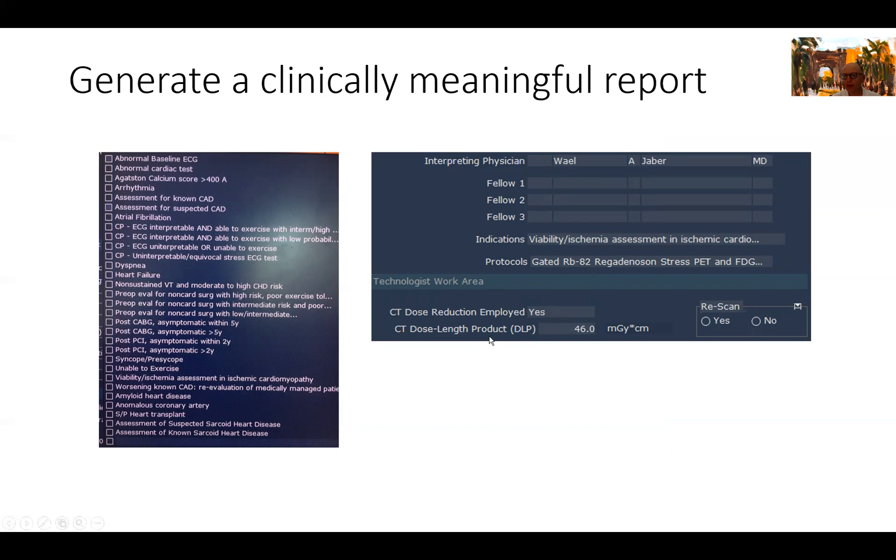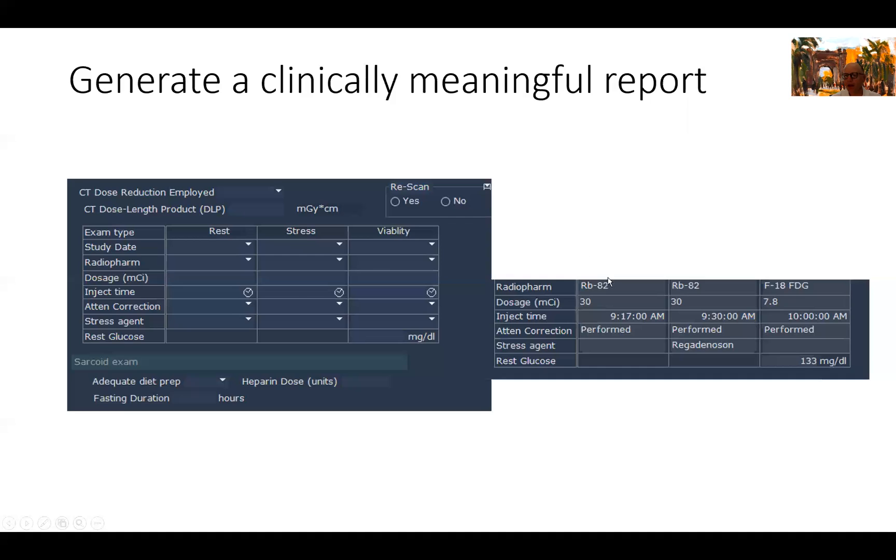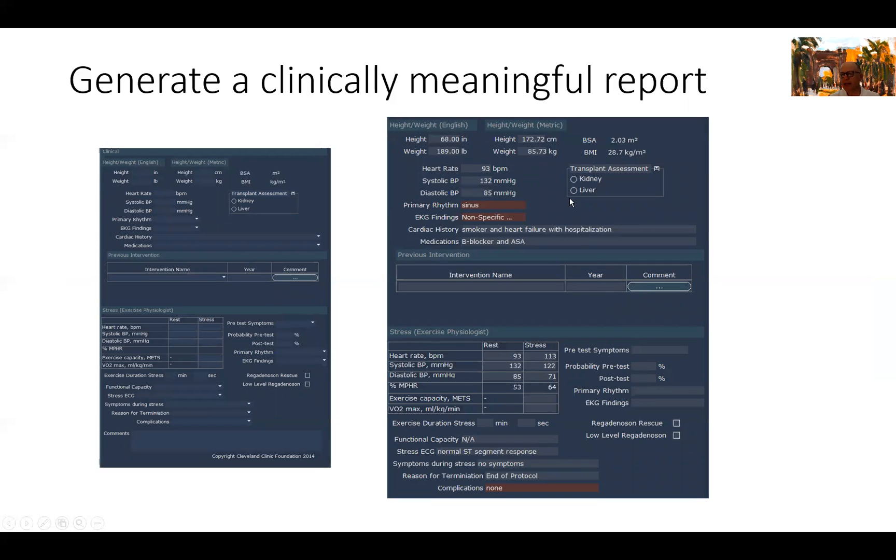Now we go to report the study. We have to report the indication for the study right here, as you can see. Then we report what type of test we did and we report the radiation dose given. In this instance, the DLP is 46 for this patient. We report the dose given, the rubidium stress and what dose of FDG, and what was the blood sugar at time of FDG image acquisition. Some clinical data about the patient: height, weight, BMI, blood pressure, medications, prior cardiac or prior history, whether they have a CABG, PCI, pacemakers, valve surgeries, any of these other issues.